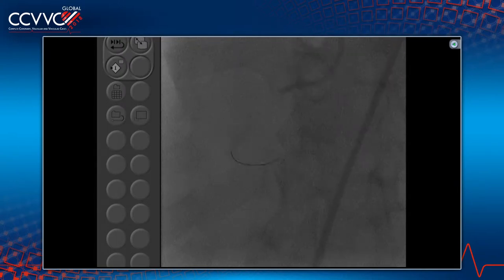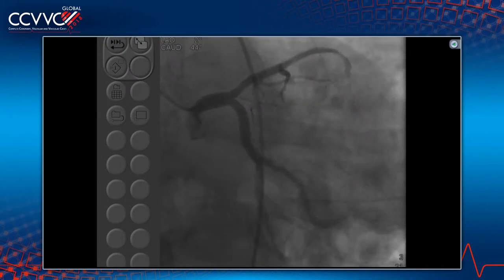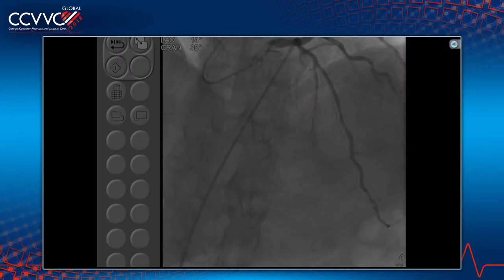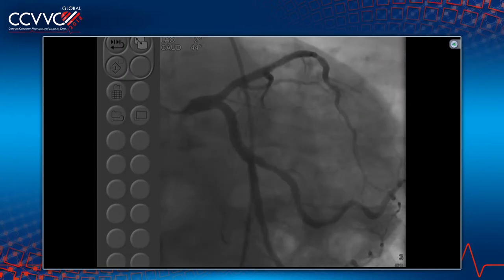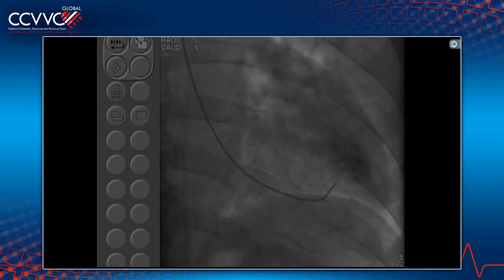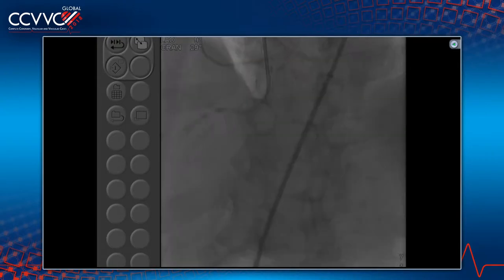Tak, any other comment about the setup? I think in the retrograde image, I don't see a lot of good filling for the PDA. If you change to the 6 French guide, where you can see good filling, then I can tell how long the occlusion is. Actually, you can see the entire vessel, it's close to 30 millimeters. If we are questioned about retrograde access here, we do have a stent across the first two septals of the LAD. I don't see a good injection there. Not an excellent filling. Let me show you more. It's not so great.